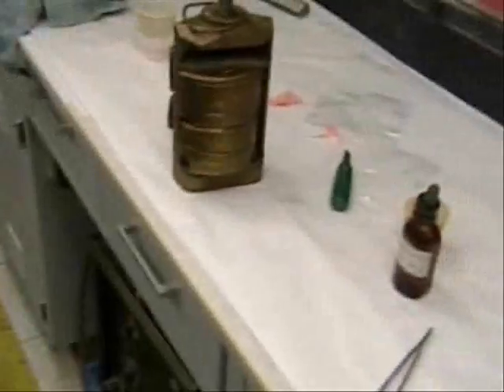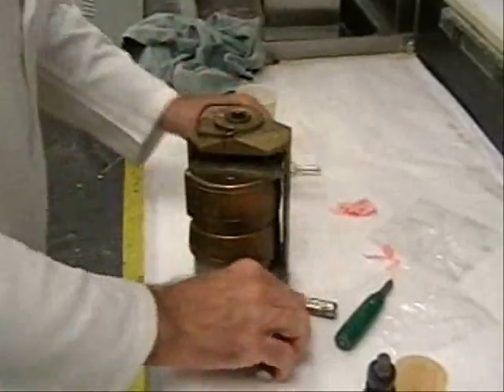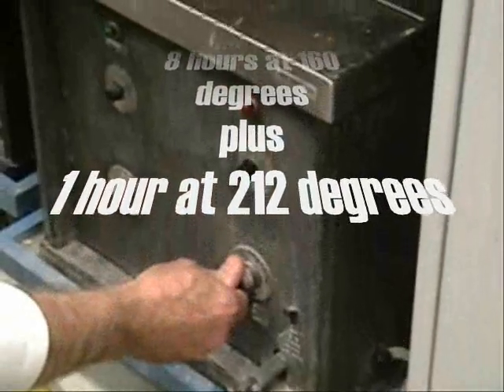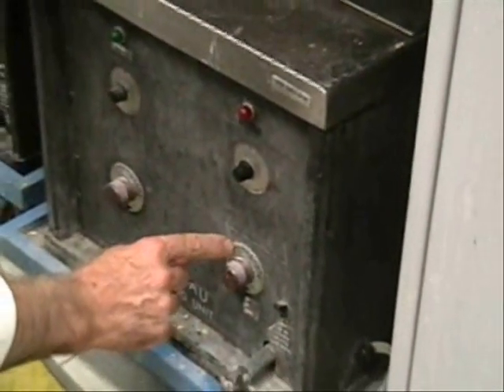The flasks are placed in a press and ready for processing. The flasks are placed in a curing tank filled with cold water. The long curing process is normally accomplished overnight, so they are cured and ready for finishing the next day.